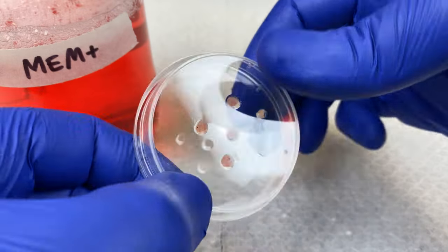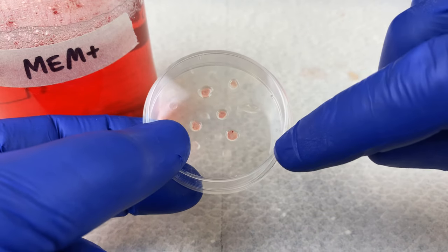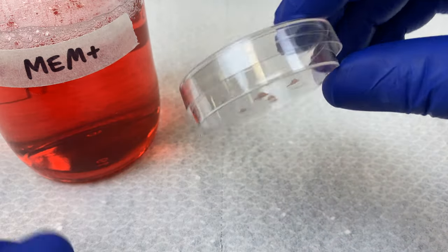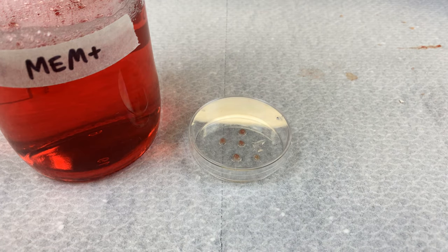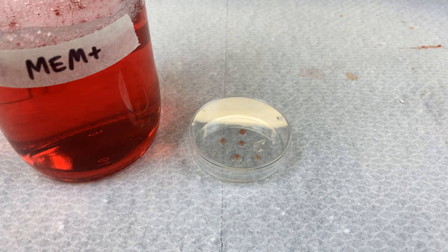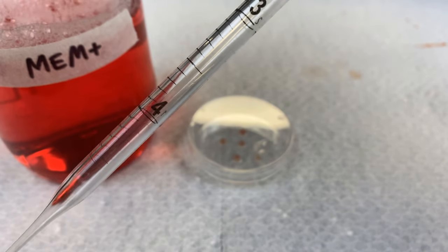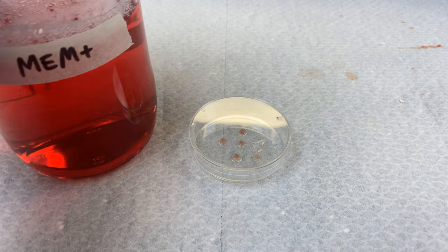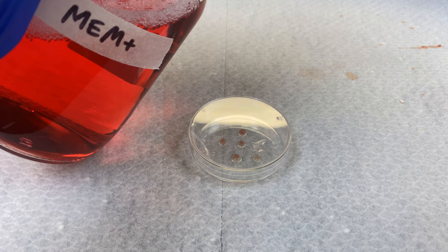Here is our explant plate that was incubating at 37 degrees for half an hour. When labeling it, please label it along the edge so we do not block the view from the microscope. The tissue looks like it's stuck pretty well. We will now add in two and a half mils of our MEM media. Do this very gently — any tissues that come unstuck from the dish will be useless.